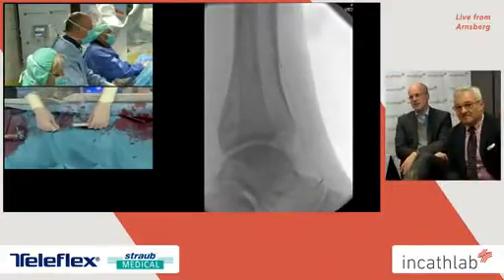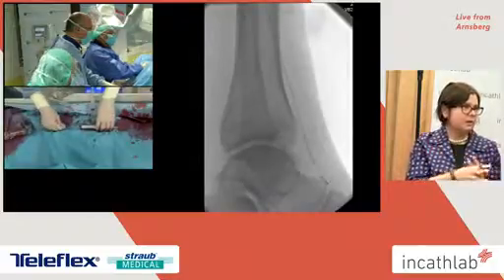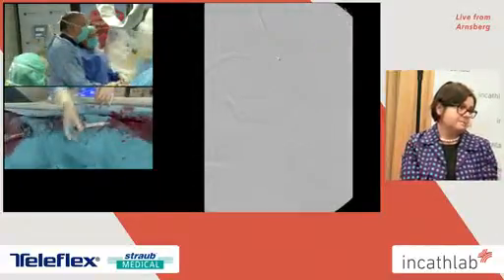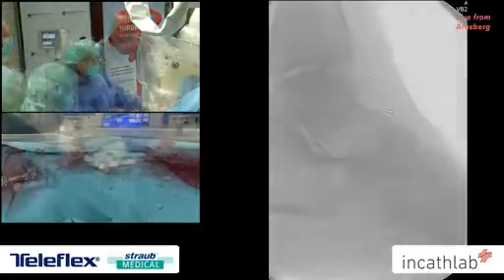But if I see that there is a technical problem, a mechanical problem, then I would maybe go for the drug-eluting stent right away. Right away, yeah. The problem is the length of the drug-eluting stent. This is a problem. We are limited in this space. That's correct.